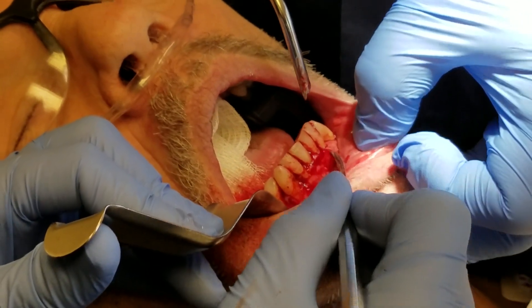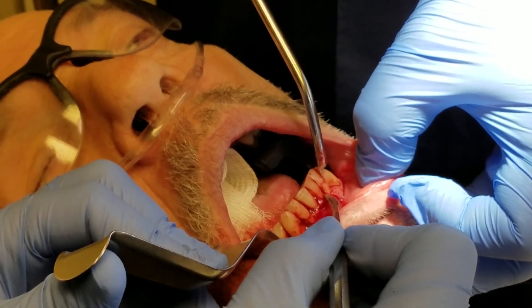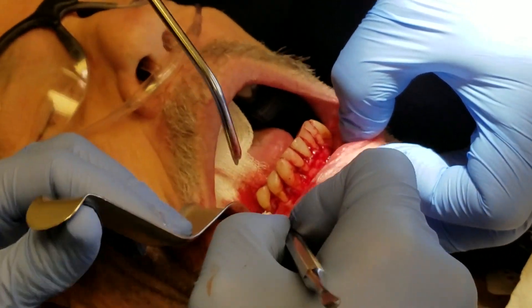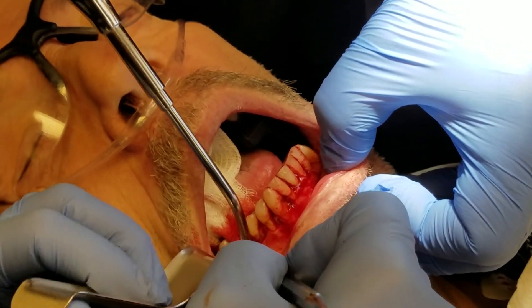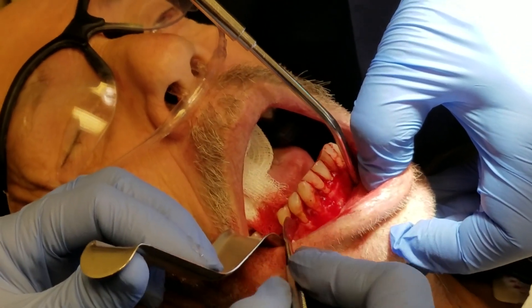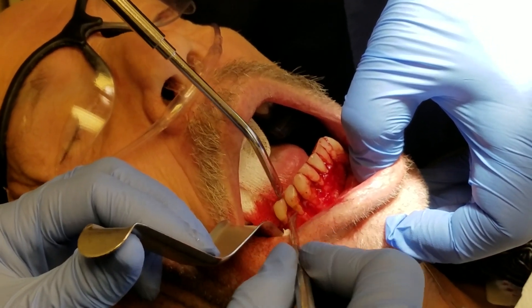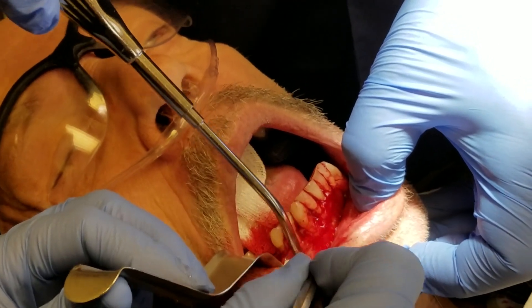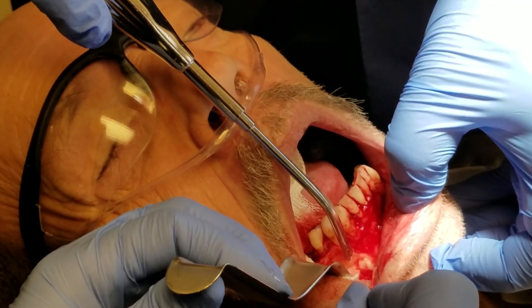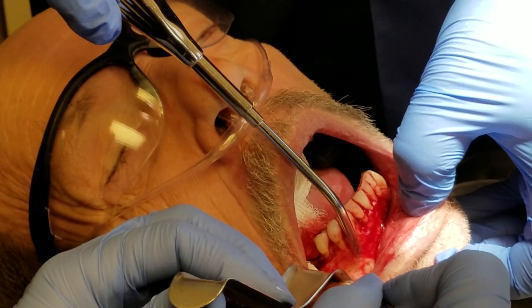What we're looking at here is an incision that went from the mesial of tooth number 23, a vertical release, full-thickness intrasulcular incision that allows me to expose the mandible. Right in this area is a cyst and an impacted extra tooth — tooth number 28S, a supernumerary tooth hiding in here. If we look down here, you can actually see the mental nerve exiting down in that area, right near my periosteal elevator.